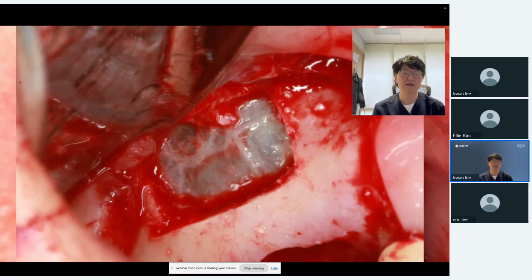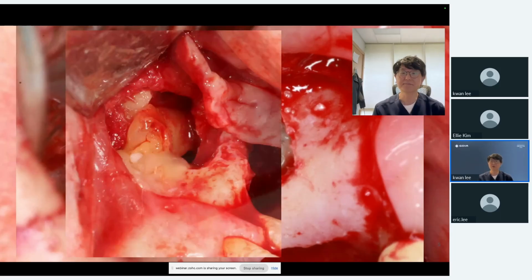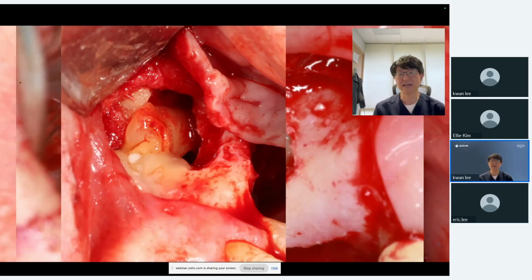So lateral sinus augmentation is really rewarding, and I think it's one of the surgical procedures you must master. Once your membrane is nicely elevated, you can graft inside the sinus chamber, depending on your choice: PRF, allograft, xenograft, whatever your cocktail of graft materials.